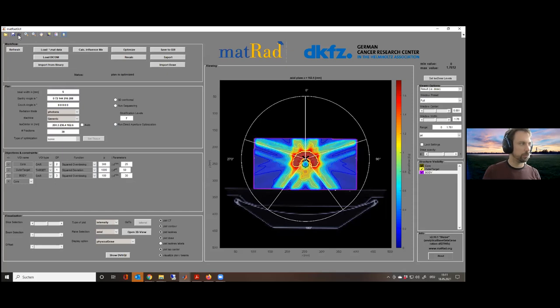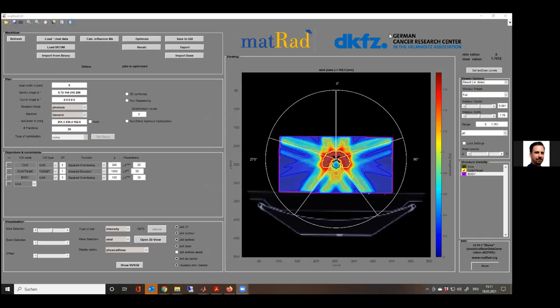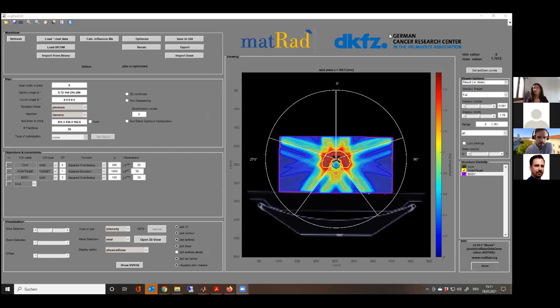Penalty factors directly relate to how important it is to achieve an objective. Improving target coverage might be possible by changing the target penalty. More organ sparing might be possible by changing those penalties. Choose another setting — it can be really extreme just to see the effect — to learn that changing penalties allows you as a planner to switch trade-offs. I'll give you a few minutes while I get something to drink. Hans Peter is here to answer questions.